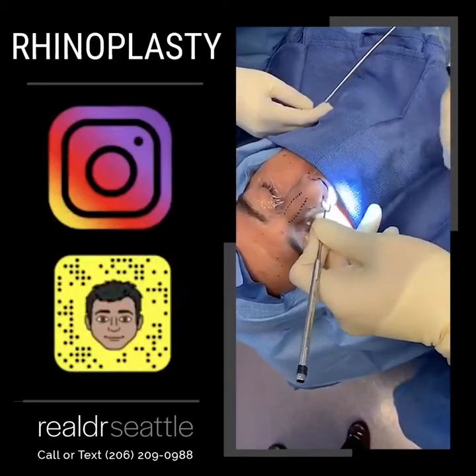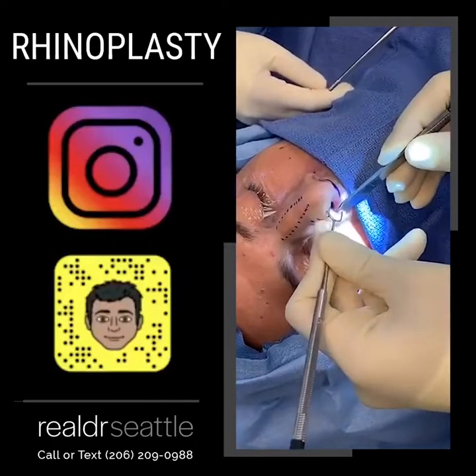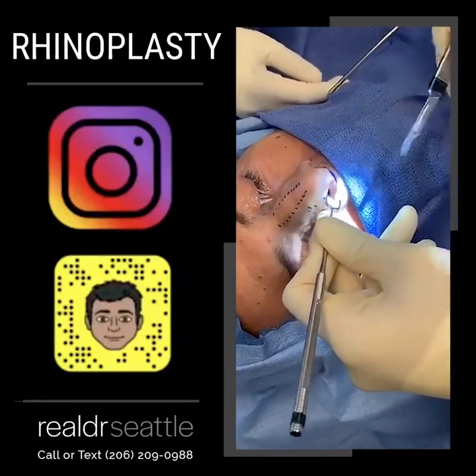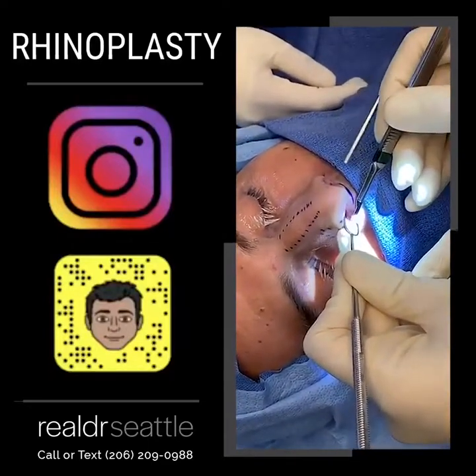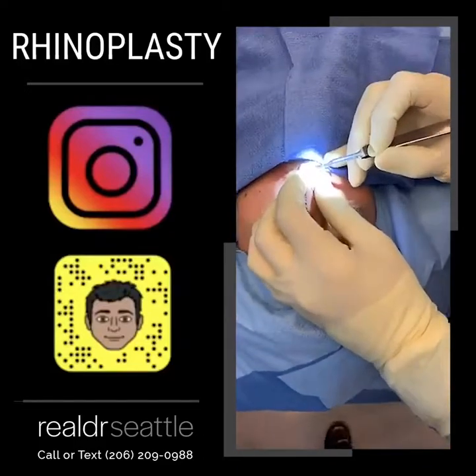This is the incision made right where the nose hair ends, and it allows you to follow the cartilage. I feel the cartilage with the back of my blade, and I can feel this right where the hair stops. So we get our hook. We're going to go all the way up.